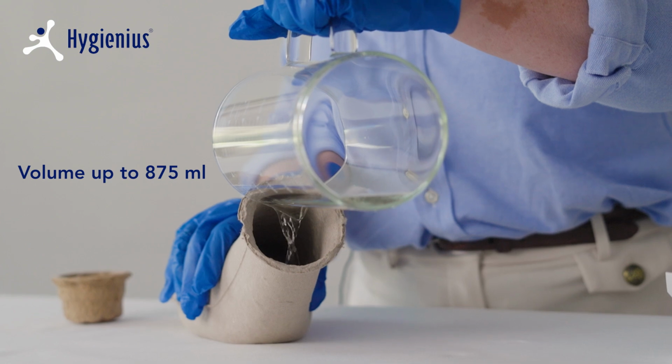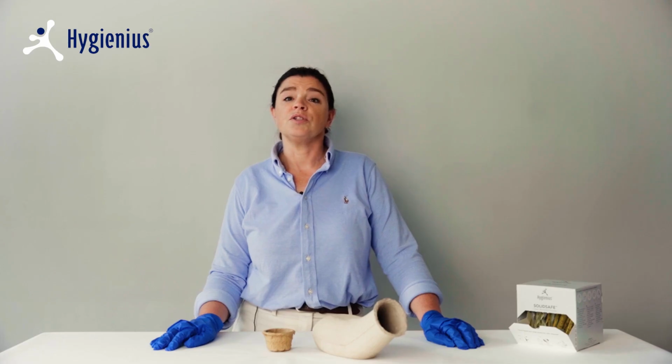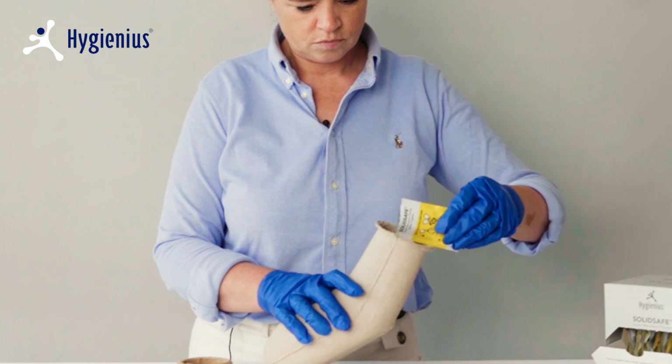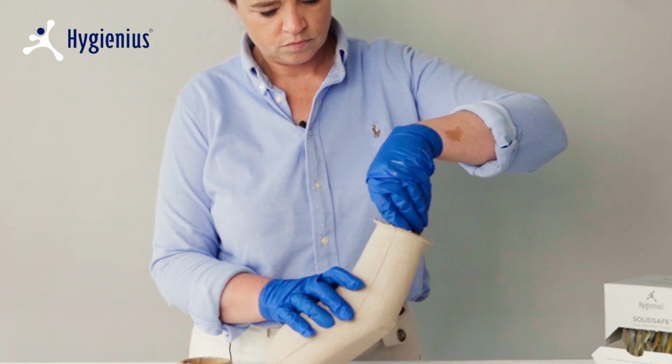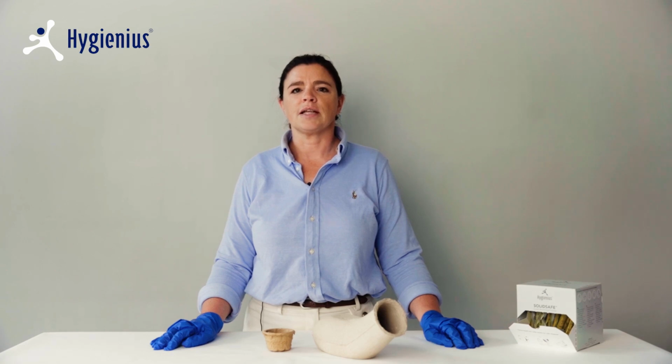PROTECTA Urinal has a capacity of 875 milliliters. Do you want to take a urine sample? Add Solid Safe after. Tilt the backrest of the bed in a reclined sitting position so that the patient leans back a little. Place the legs at a small angle and slightly apart.